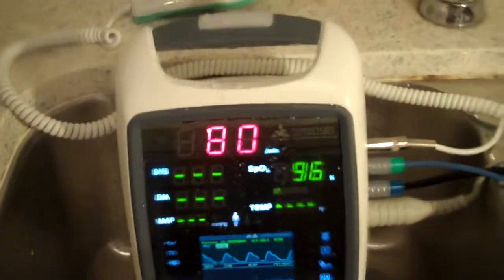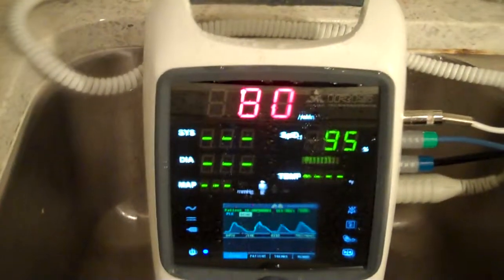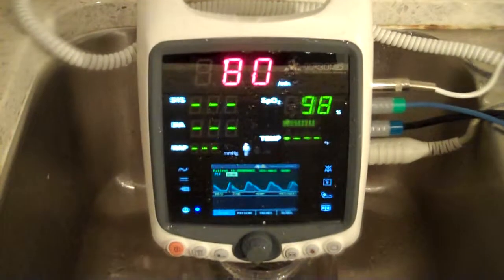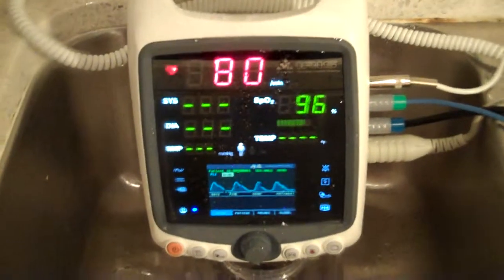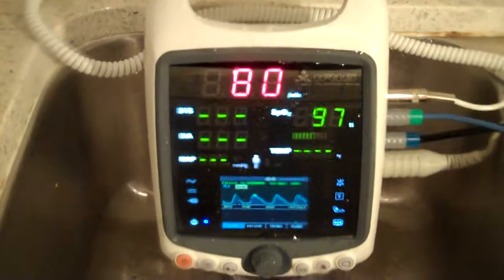It's used for transport, and it can also be used in clinical or hospital situations. It has a battery which can be used up to 5 hours, and it can be connected to the outlet. Thank you, everyone, for watching.